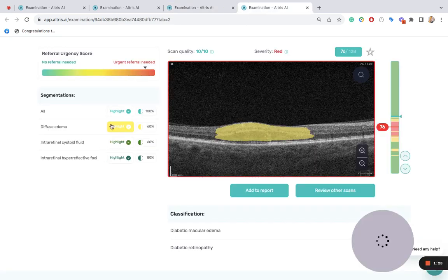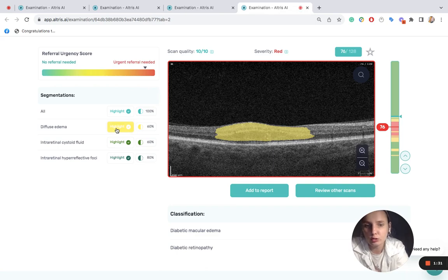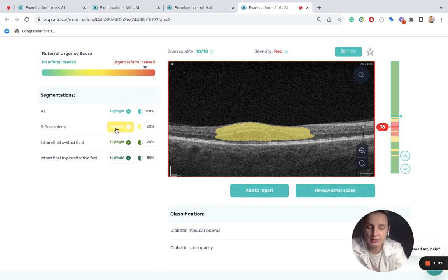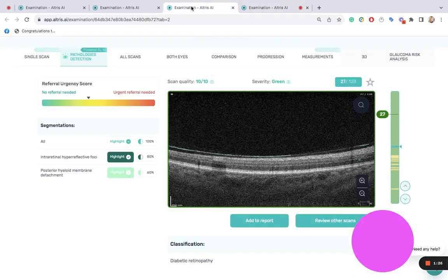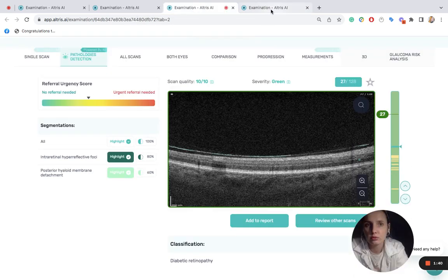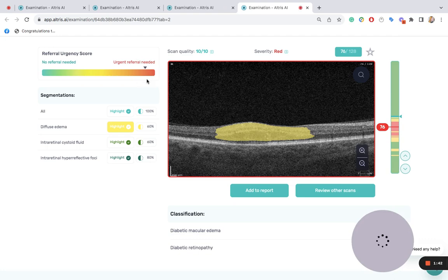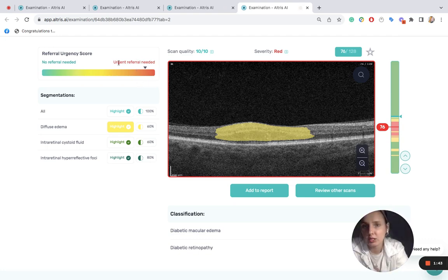We see more noticeable edema. We also see that comparing to the previous examination, the urgency score color has changed from almost yellow to almost red, which means that urgent referral is needed.